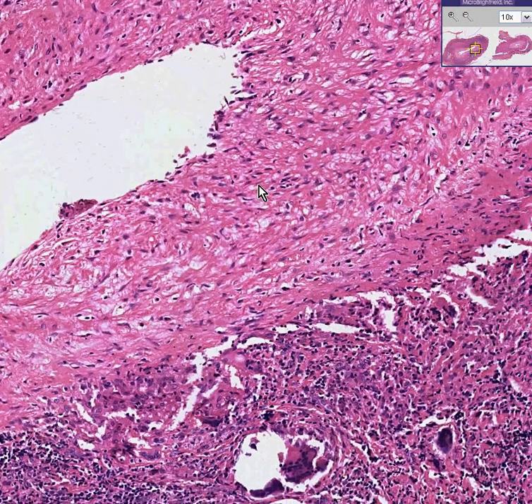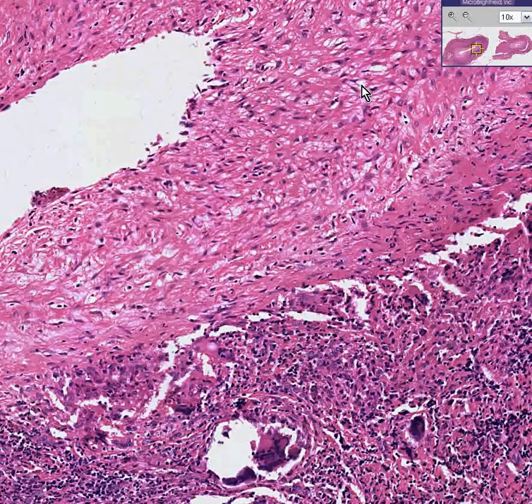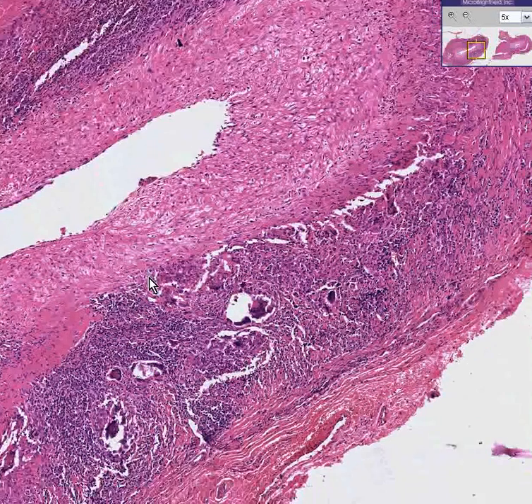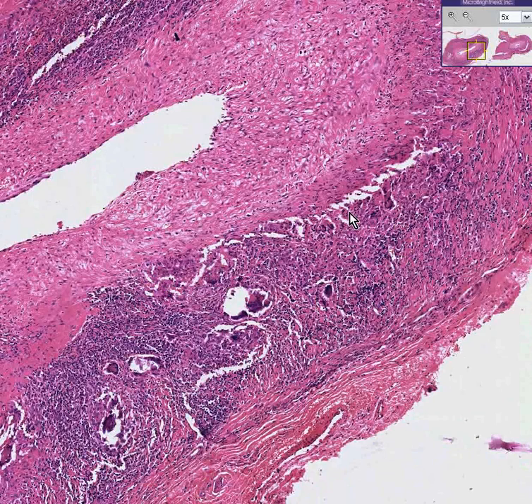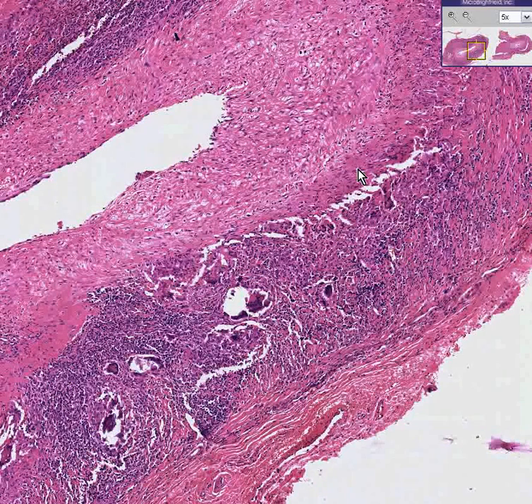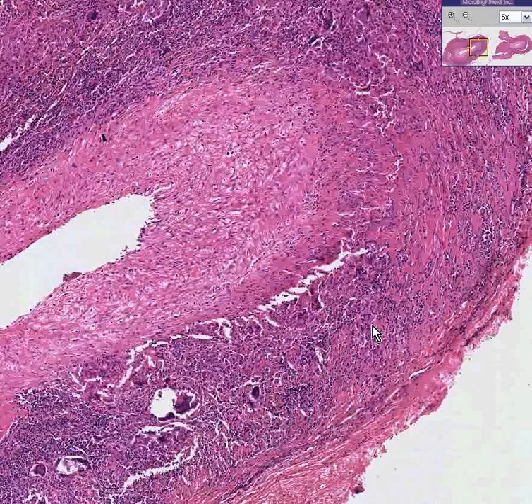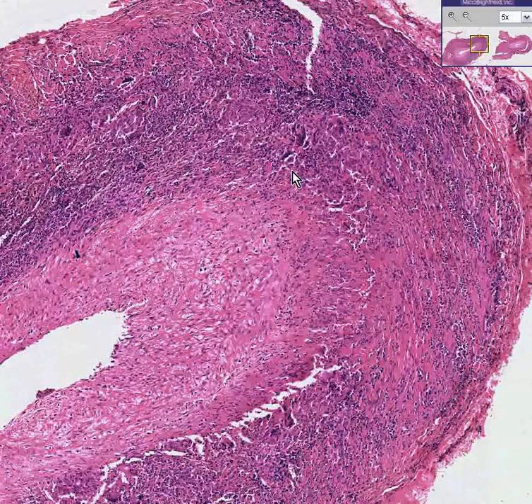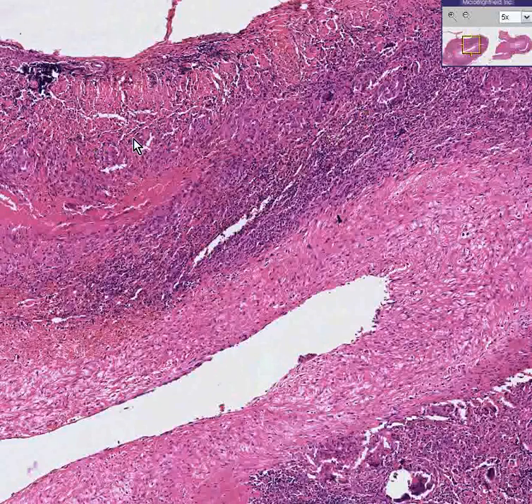The muscular smooth muscle layers underneath look pretty good for a while, but then within the muscular layer you see an inflammatory cell infiltrate disrupting it. You can see significant disruption here and significant disruption here.